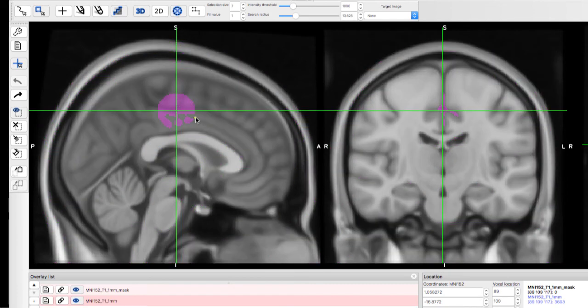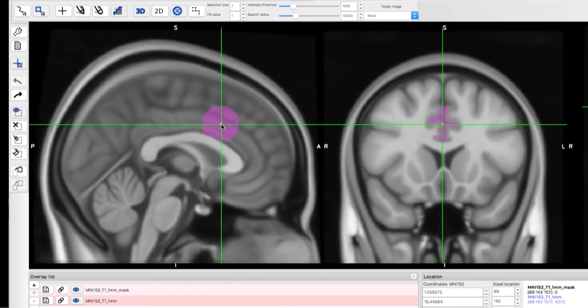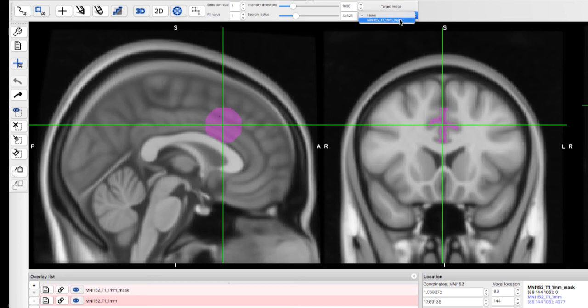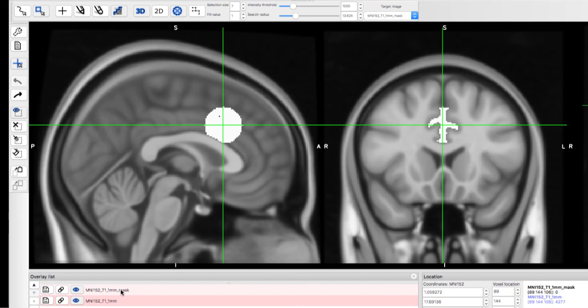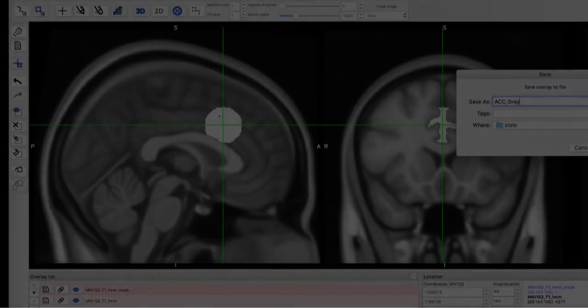If you select the Limit to Radius button, you can combine this with a limited search radius. Once you have the voxels you want, go to the Target Image drop-down menu and select the copy of the parent image. Then, click the Fill voxels button. You can save it by clicking on the Disk button.